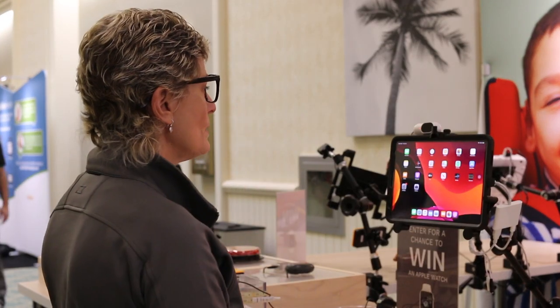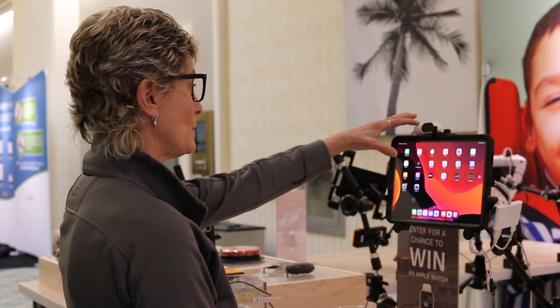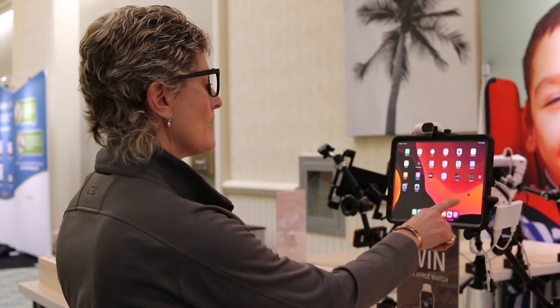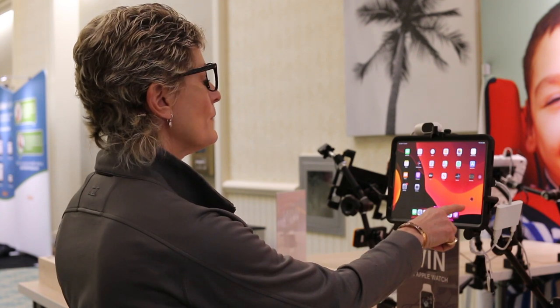So I'm going to put the glasses on, and what you're going to notice is that there's a camera. This is the TRACKER Pro up here — it is new. We've worked on our new camera and also a new design, but you'll notice that across the screen, as I move my head left, right, up, down, I can move the cursor.